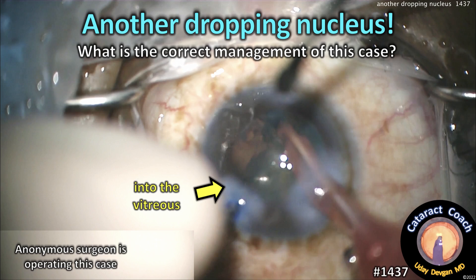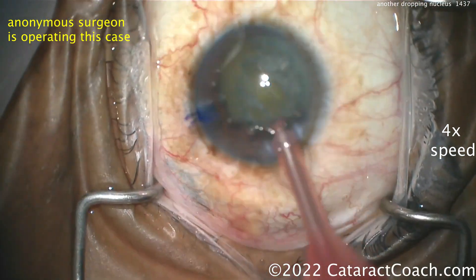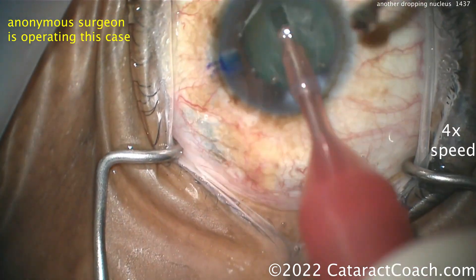From cataractcoach.com, another dropping nucleus case. What's the correct management? There goes the nucleus into the vitreous again. We have an anonymous surgeon operating this case — let's speed things up here at four times normal speed as they're getting the groove.